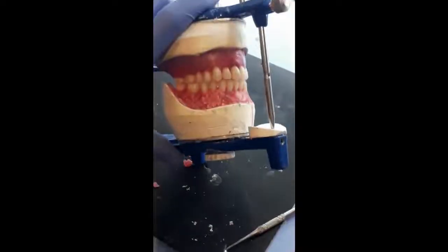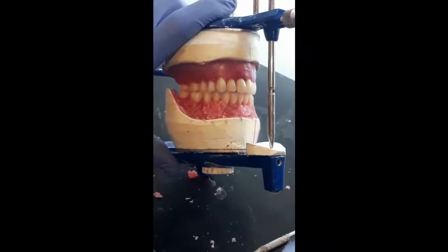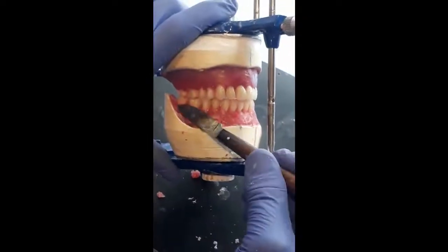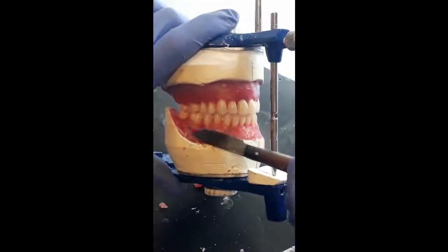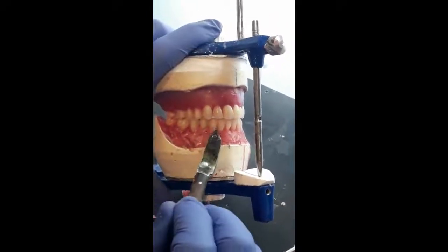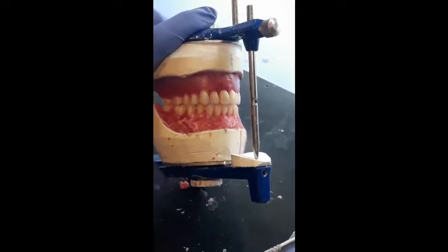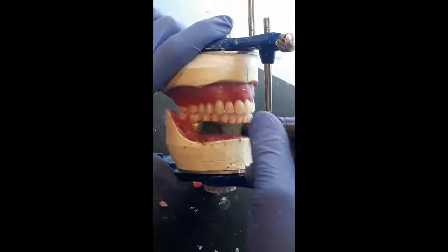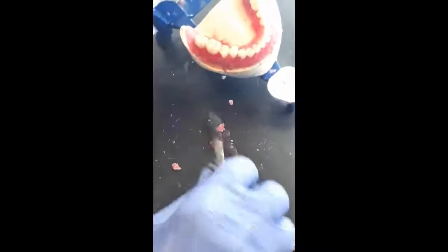As you can see, we have nice intercuspation in the centric relation. As we mentioned earlier, the maximum intercuspation and centric relation, or the centric occlusion and centric relation, in the complete denture, they coincide with each other. We fix it from the lingual side by adding some wax.